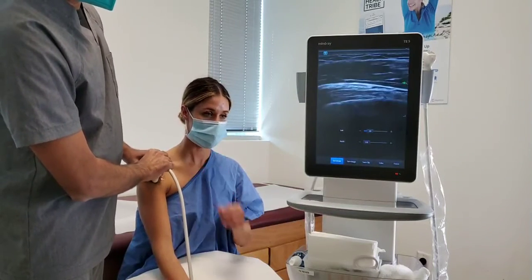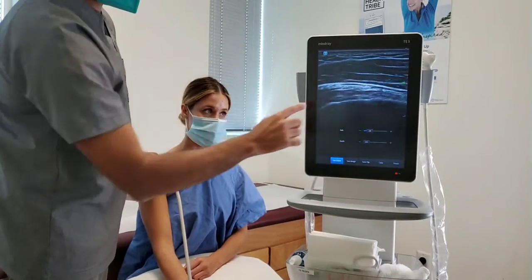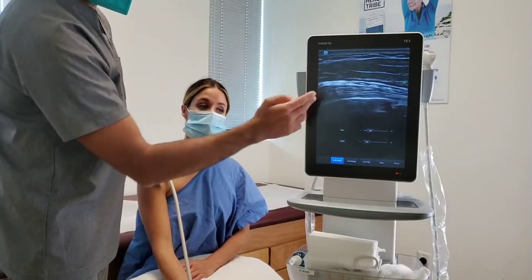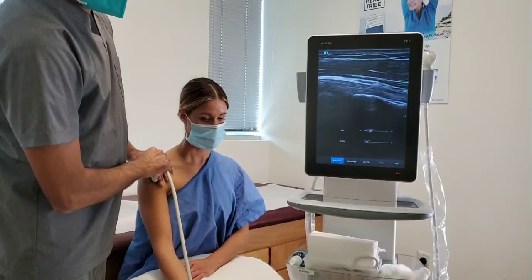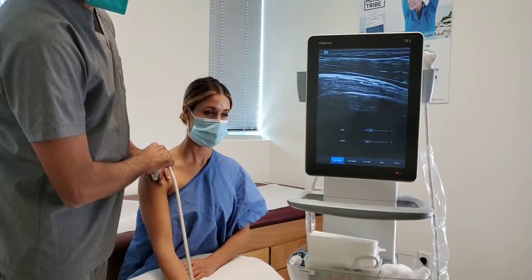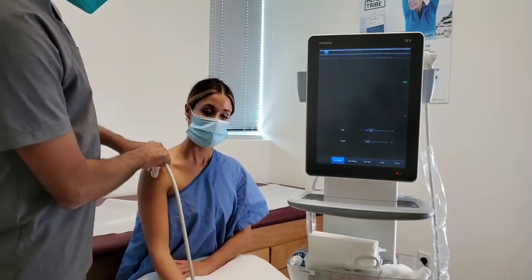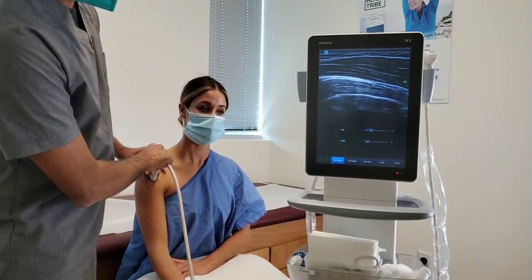Then I turn my ultrasound, and then I can see these fibers now going in this direction. Well, now I'm looking at the biceps tendon in what we call long axis. So now I'm looking along the cylinder rather than cutting the cylinder and looking at a circle. This is the tendon fibers themselves. And what we can see here is all of those fibers are all kind of parallel. They're all lined up. And this is why I describe tendons as being like the bristles of a paintbrush all lined up together, because you can see that those bristles are all kind of lined up and in a row.